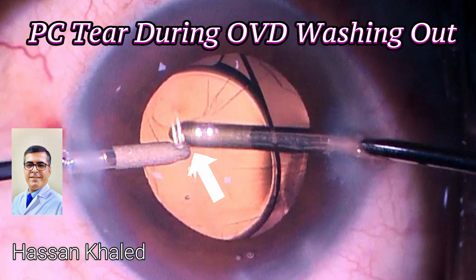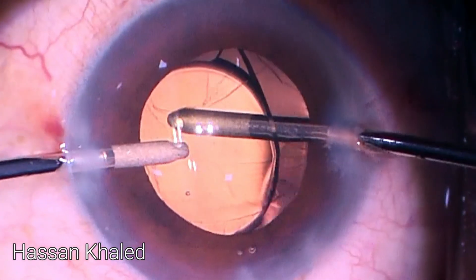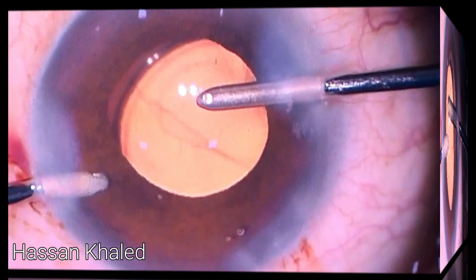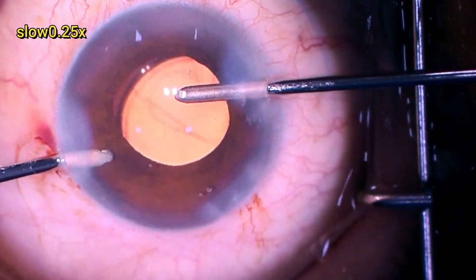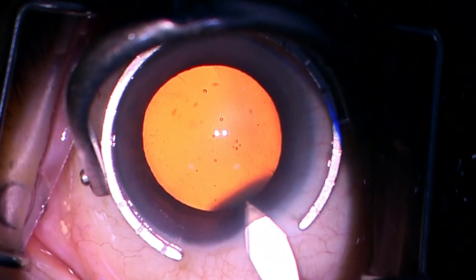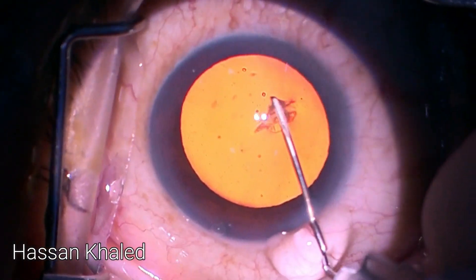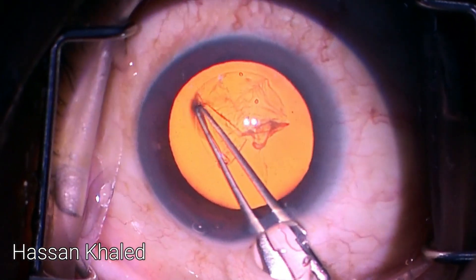A posterior capsule tear occurred during OVD washing — while washing out the viscoelastic behind the IOL, a posterior capsule tear occurred which subsequently enlarged during continued irrigation of the anterior chamber. This raises the question: should we leave the IOL in place, or extract it and perform an anterior vitrectomy, replacing it with a three-piece IOL?